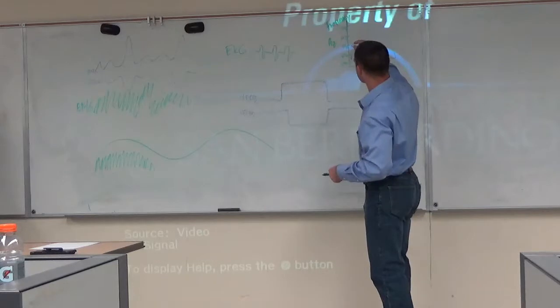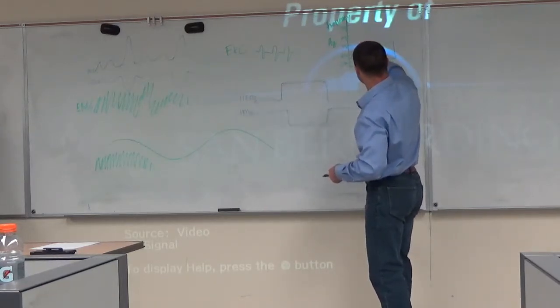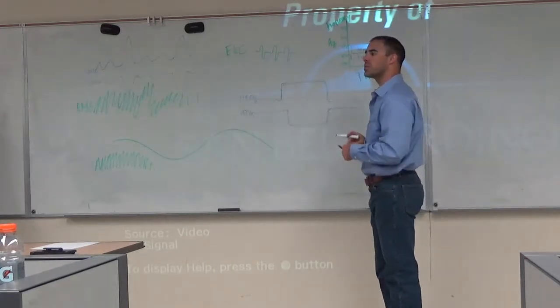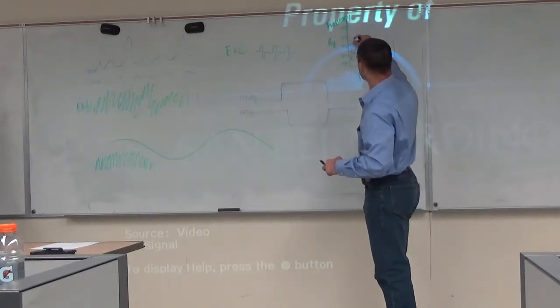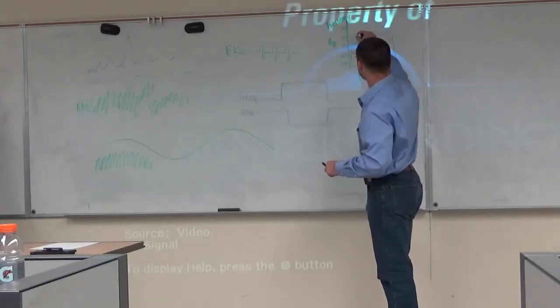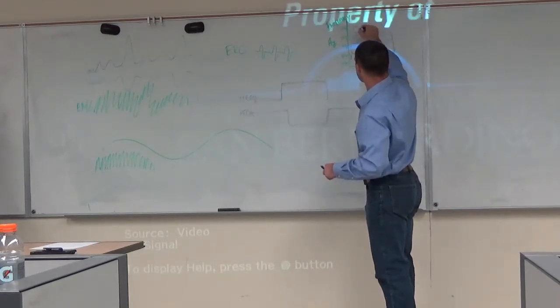Now to your question, what is alpha? It tends to be about this frequency, about 8 to 12 hertz. You come up a little higher, say about 12 to 20, beta. And as you get higher, you're going to have gamma.